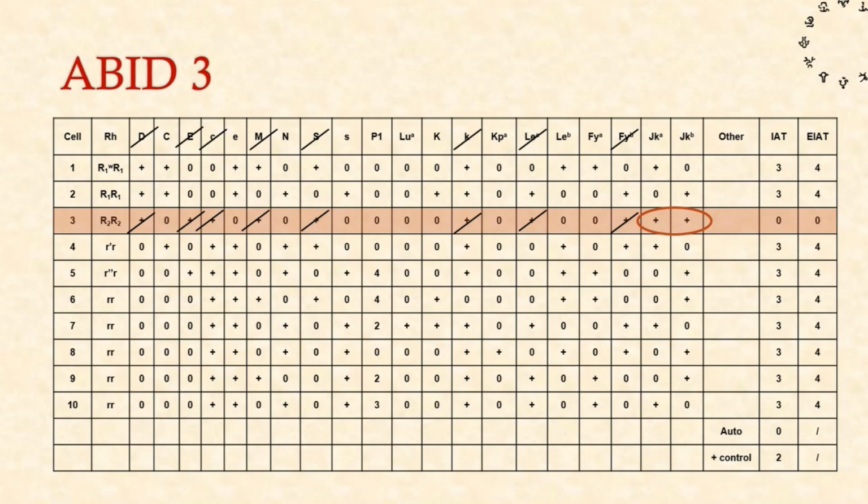Get rid of these ones, all single expressions. So you can see from this panel, even though you do have one negative, there's quite a few things that you can't exclude there. You could give Rh matched if you wanted to, or antigen matched, but in a lot of cases you don't want to waste precious phenotyped units. You do need to exclude the presence of these antibodies because we've identified something, so we need to make sure that there's nothing underneath so that we don't give a patient a transfusion reaction.